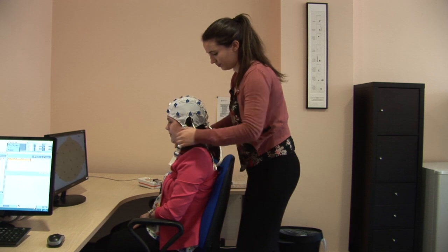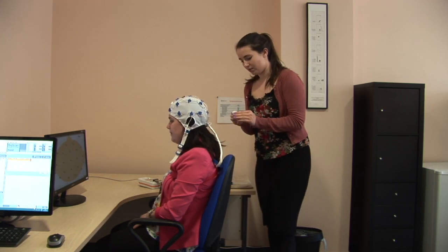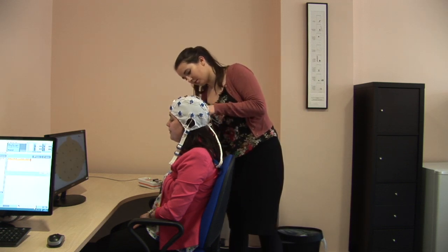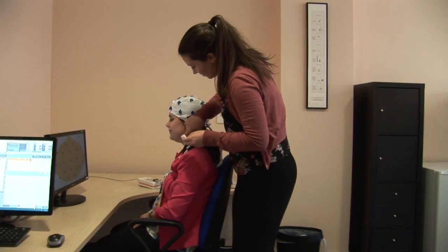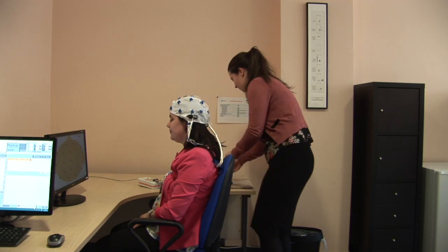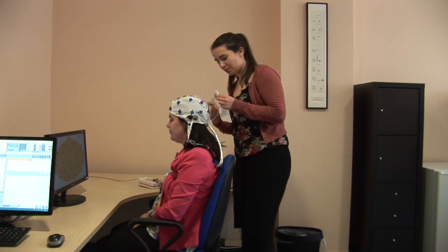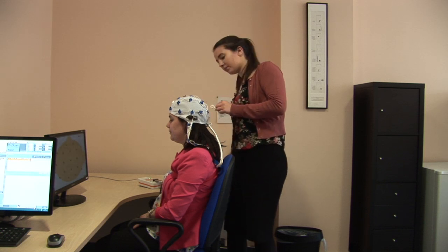In order for us to collect EEG data, you need to wear an EEG cap. Now, an EEG cap is a standard piece of equipment used in thousands of hospitals and clinics and research institutions all over the world. Measuring EEG is the same as measuring heart rate using a heart rate monitor. Essentially, there are electrodes which sit on your head and passively measure what your brain is doing. There's no impulse into your brain, all they do is sit and listen.